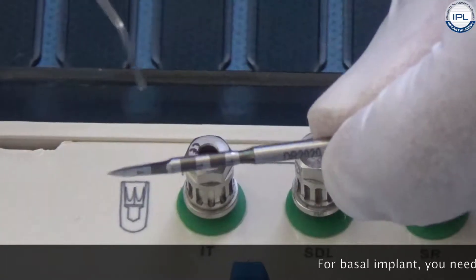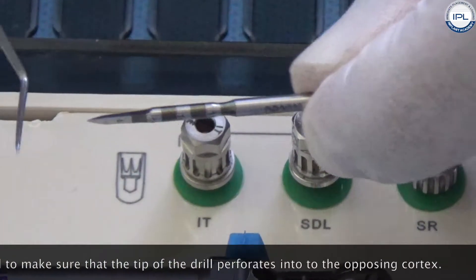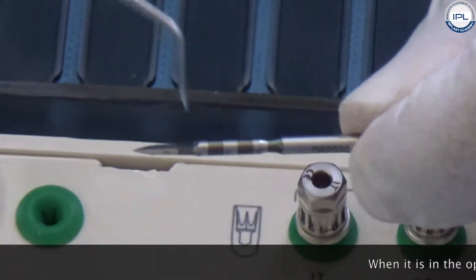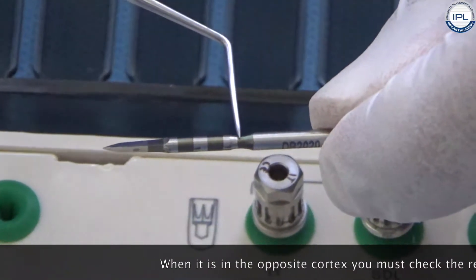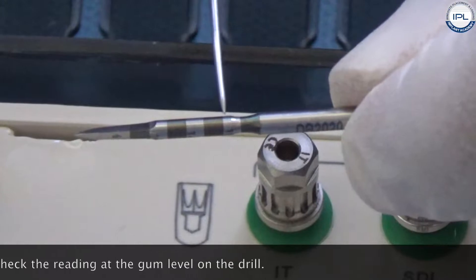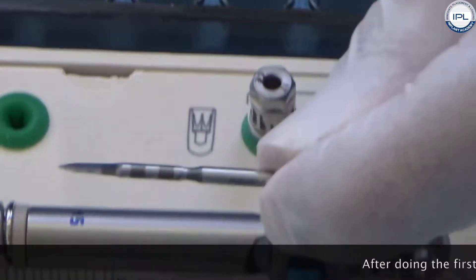For basal implants you need to make sure that the tip of this drill perforates into the opposing cortex. When it is in the opposing cortex you must check the reading at the gum level on the drill. If it is 18 or 20 or 14, that will be the length of your basal implant. So this is your first drill.